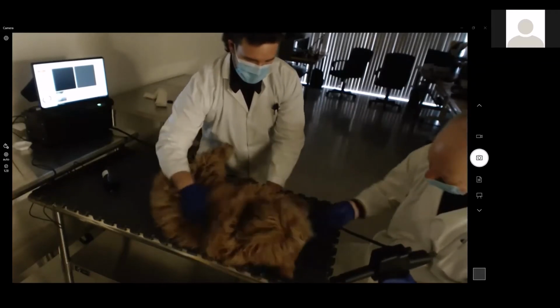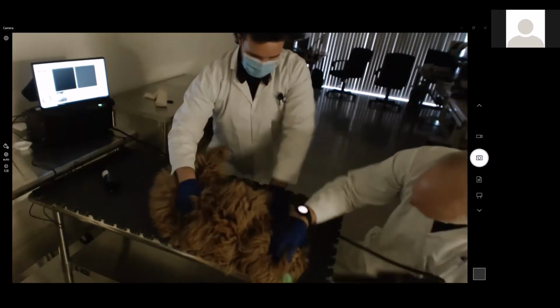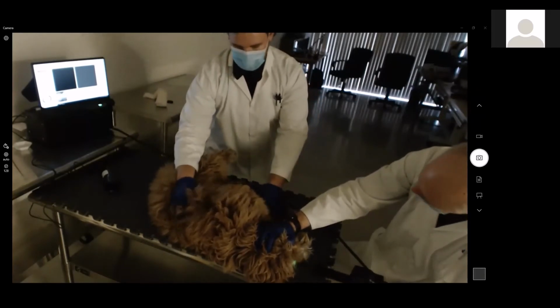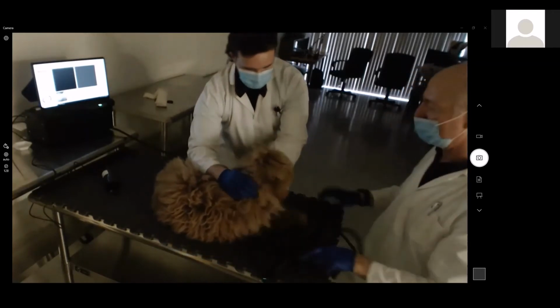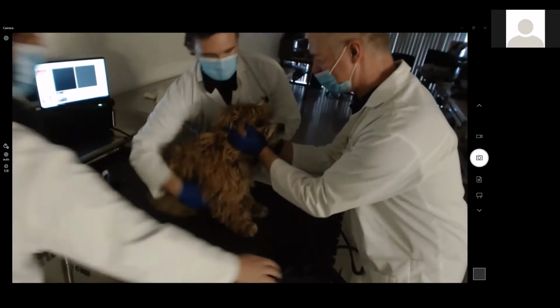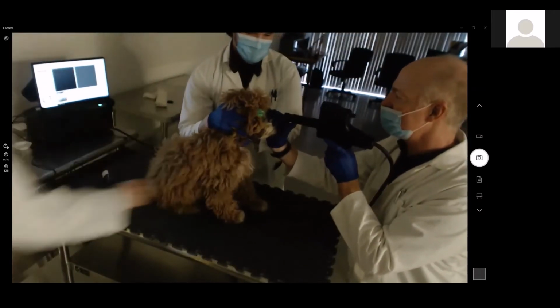It's okay. Here, I've got another one for you. Here you go. You're doing pretty good, man. Good boy, you are being fussy. Okay, I need you to hold. Do me a favor, Trenton. I'd like you to hold him up here, just hold his head still like this. Yeah, there you go. And I'll just work his nose and his eyes.